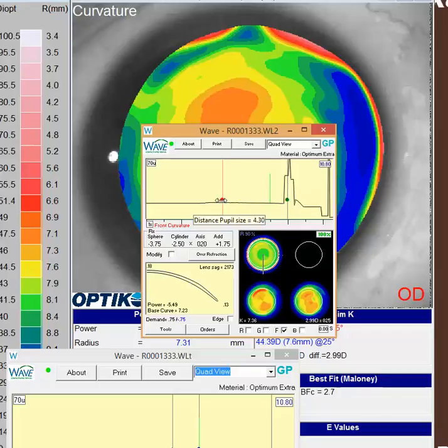So I would almost rather make sure we can hone in that distance so they're happy with the distance vision, and then after that try to reel back in the reading either by over plussing the other eye a little bit, or then inching back up, or creeping back up on the bifocal design afterward. You're likely going to have to use a little bit of trial and error, and unfortunately that can run up the remakes on you, but it's something that you sometimes will have to just work with a little bit.